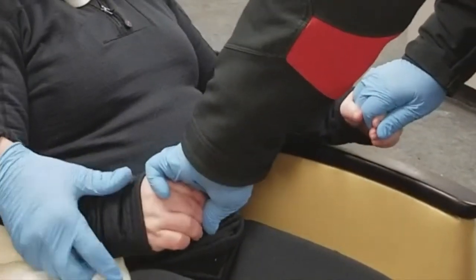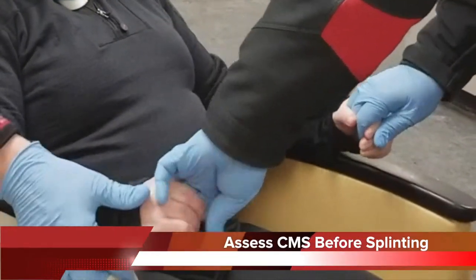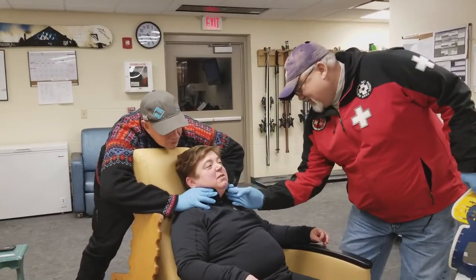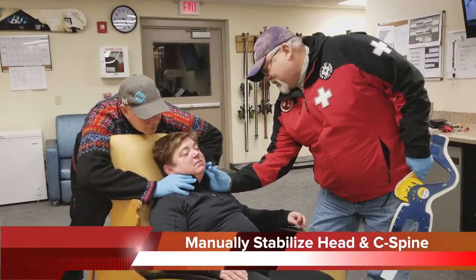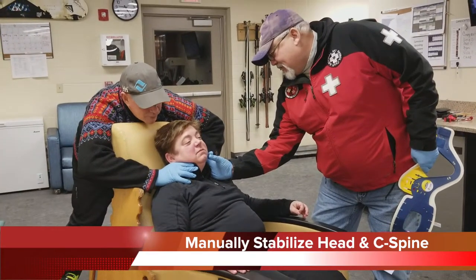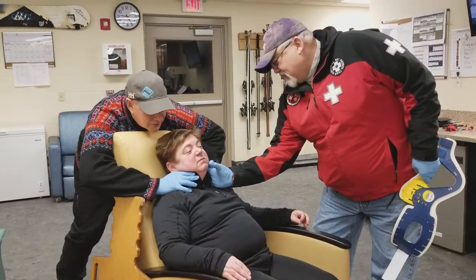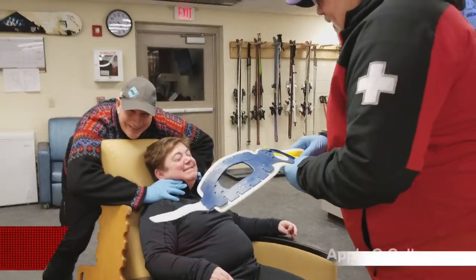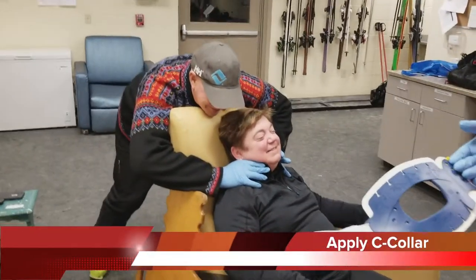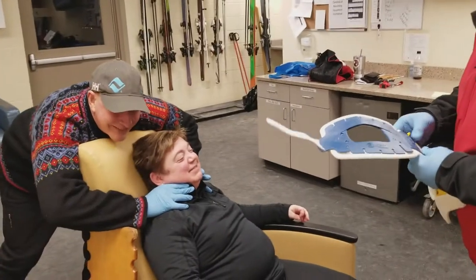Take my hand. Squeeze, squeeze, squeeze. Do you have any tingling in your face — numbness, tingling here? No. What I'm going to do is put this C-collar on you so that will immobilize your neck so it doesn't move around and harm it any further.